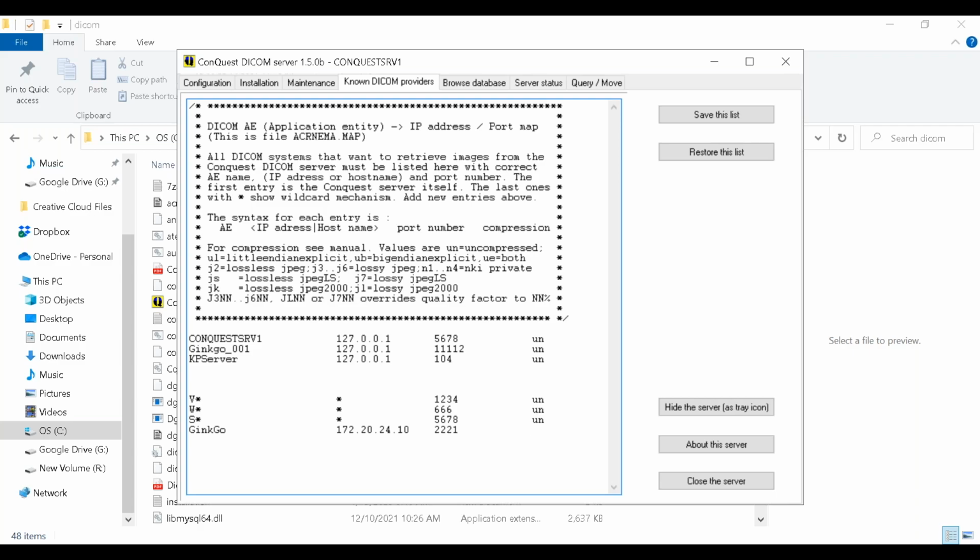And then I'm going to tab over to this, and it's going to ask me, do you want to send it in any specific type of image? UN is uncompressed. Now, here's where a lot of people make mistakes. They just sort of leave the cursor there. How does this machine know you're done with that line? Well, there's something called carriage return. Carriage return is enter. You've got to enter. Once you move that cursor down to the bottom by hitting enter, it puts it in there.